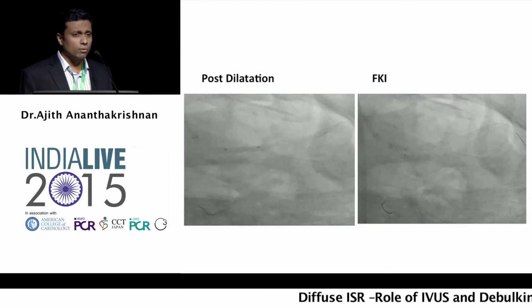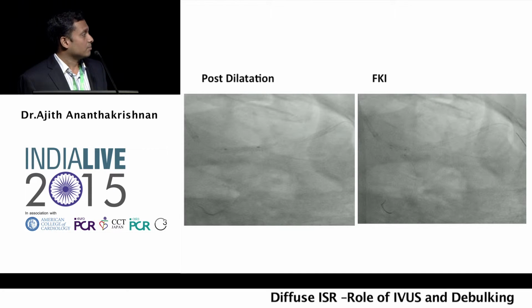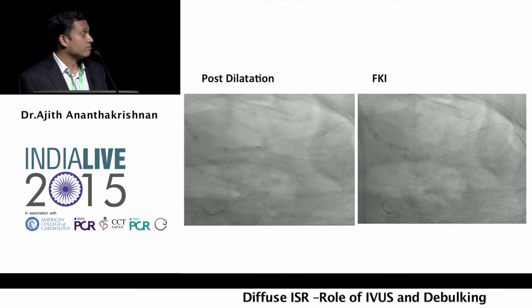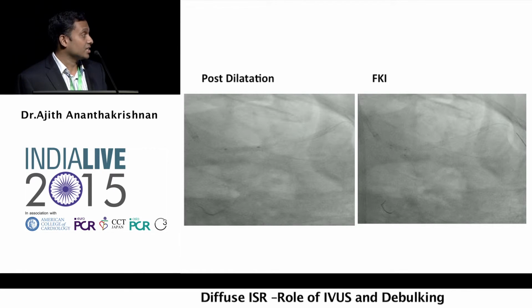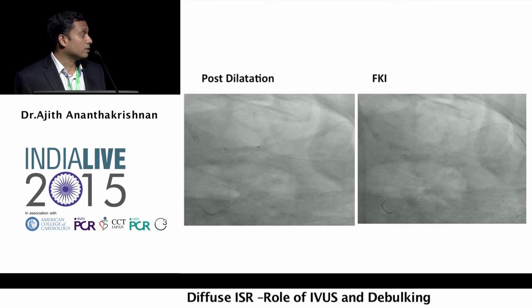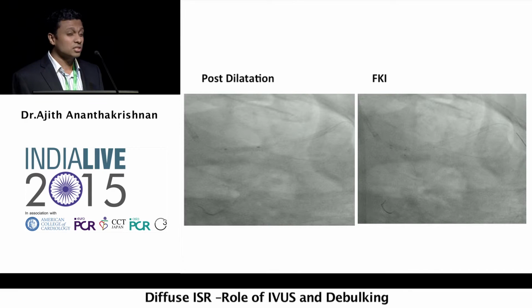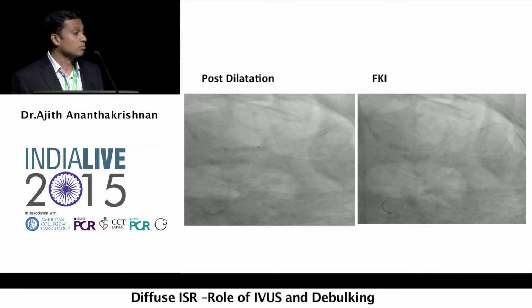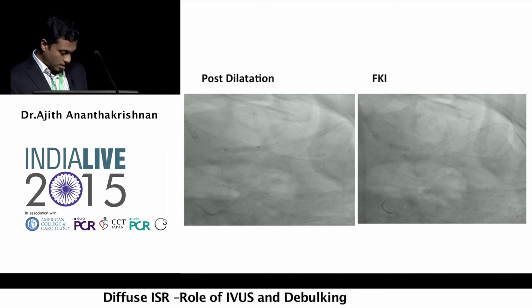We followed up with 4 and 4.5 post-dilatation, aggressive post-dilatation actually, because that area was not yielding properly. And then we followed up with the 3.5 in LM to LAD, and then a 3 in LM to circumflex, final kissing inflation. Circumflex dimension, according to IVUS, was 3.2, so we used a 3 balloon. Our idea was not to stent the circumflex because, as we saw, there was not much plaque burden in the circumflex. We just wanted to open the struts, and since we used a 3 balloon.